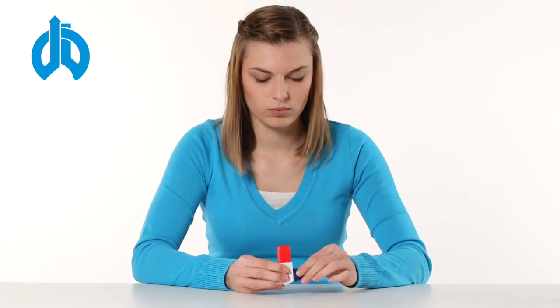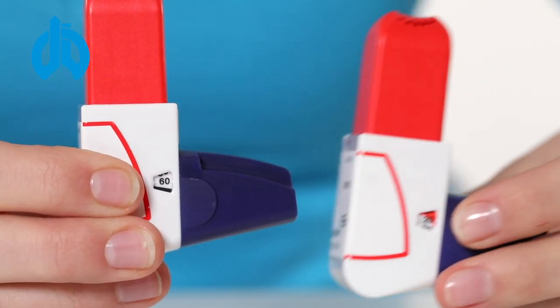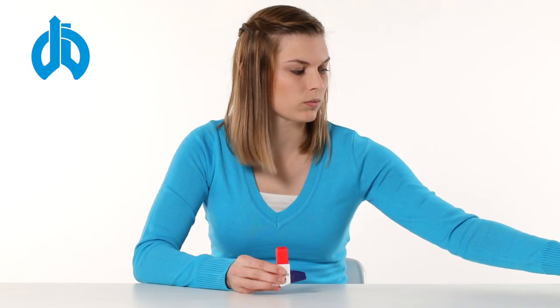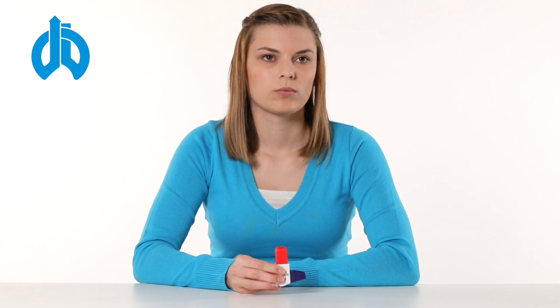The device has a counter to indicate the doses remaining in the inhaler. When the counter's background turns red, you need to get a new prescription. If you accidentally press the device more than once, or if you exhale into the inhaler, tap the mouthpiece on a table surface or on your hand to remove the powder, then start from the beginning.